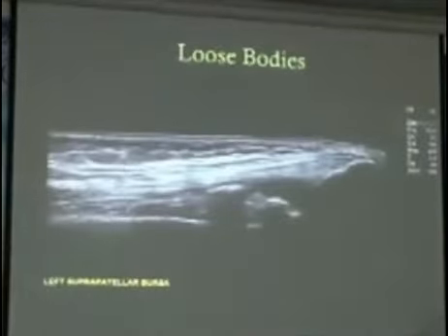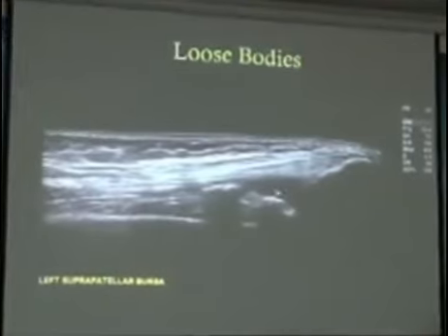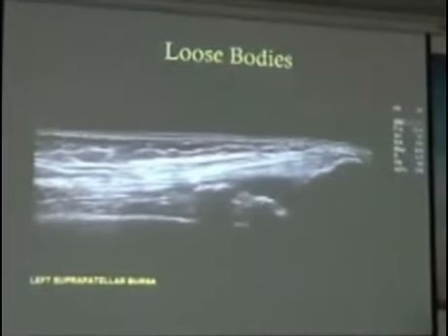So this is the patient. You can see here, this is the suprapatellar recess, and there are these calcified areas within that.